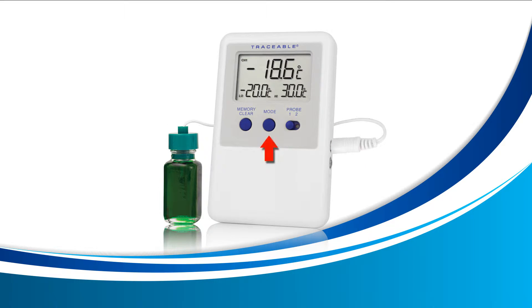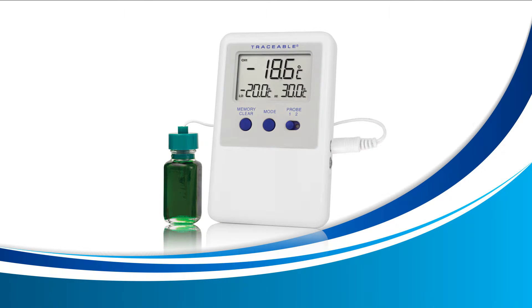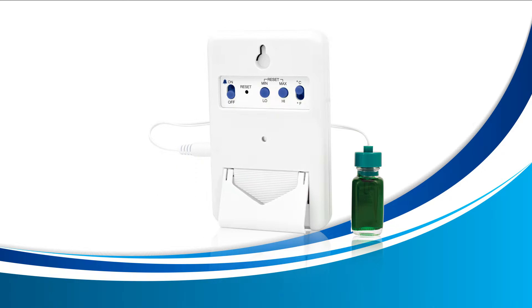First, press the mode button on the front of your device until the words high and low appear on your screen. Once these words appear, you're now inside alarm display mode and we can begin to set our high and low alarms. Turn the unit around and locate the low and high buttons — these are the buttons we'll be using to set our high and low alarms.